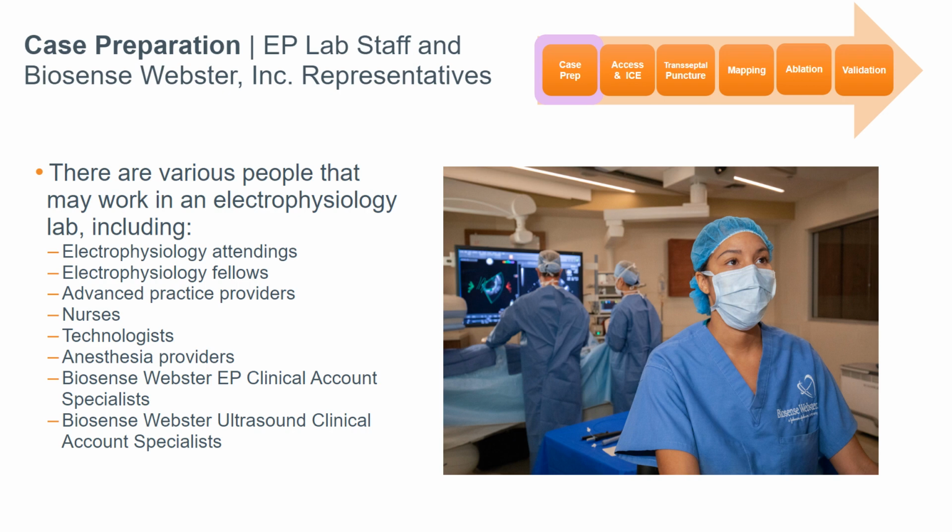Anesthesia providers may provide sedation and airway management, and in other labs, this may be done by the EP nursing staff. Biosense Webster representatives may also be present. Reps may help operate the CARTO 3 system workstation and provide valuable product information to physicians and lab staff.